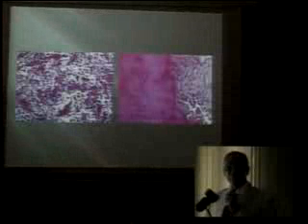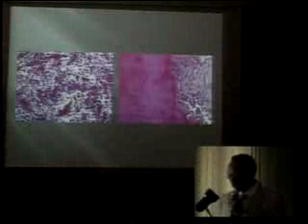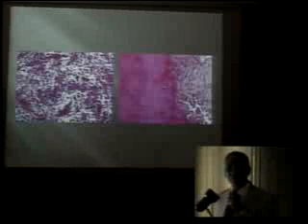Now look at the bone flap. You can see it from within with the erosions. This is the area that had been filled by the grains. And this is the brain now, freed from the capsule, looking forward to expanding back to its place. And that is a specimen being seen by Professor Hassan. And he's reporting about the neutrophils and lymphocytes, and this is densely sclerotic bone. And again, lymphocytes, monocytes, neutrophilia. This is from the capsule.